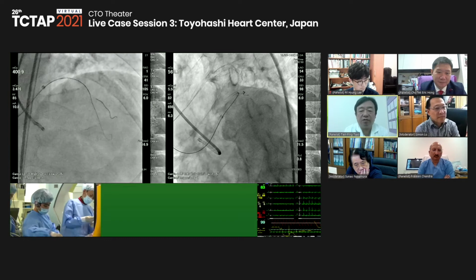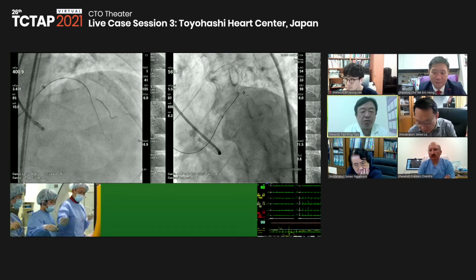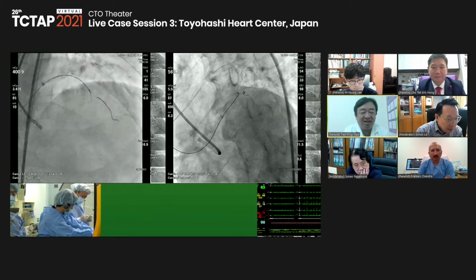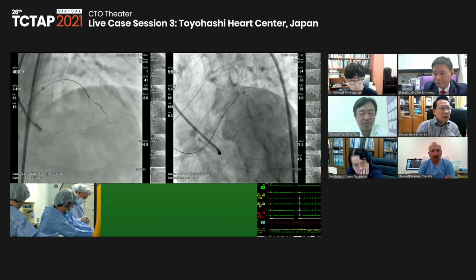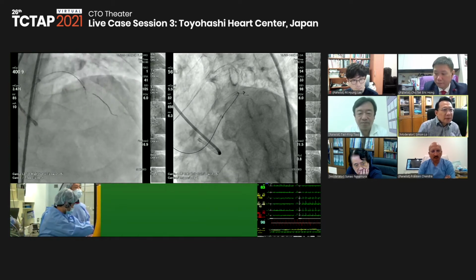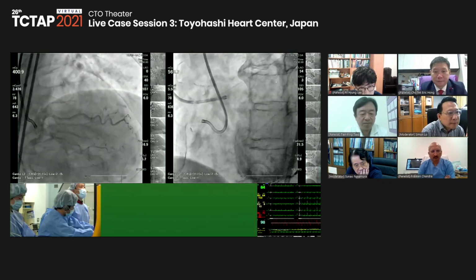So Dr. Nasu, can I have a question? Yes. For this case, you prefer to use a double lumen catheter instead of a microcatheter, right? Yes, usually. Of course, we can use a microcatheter instead of the DLC now.